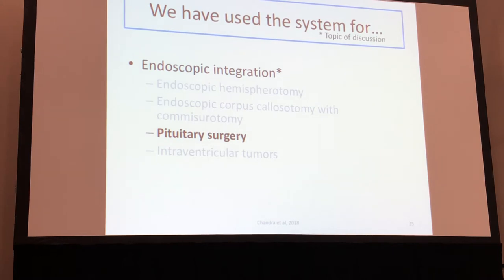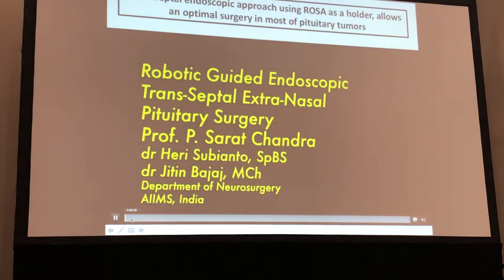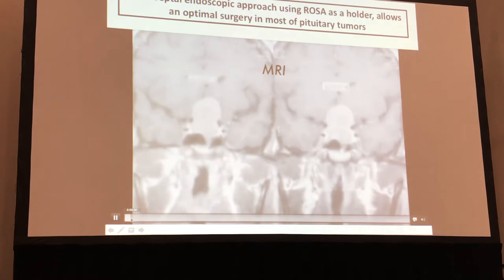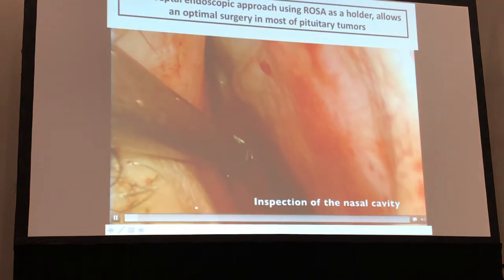Then we extended the system for other non-epilepsy indications like pituitary surgery. So I can show you a brief video. So in pituitary surgery, because we don't have the option of the assistant providing you that dynamic endoscopic view, we adopted a transseptal approach, which actually worked out very well.